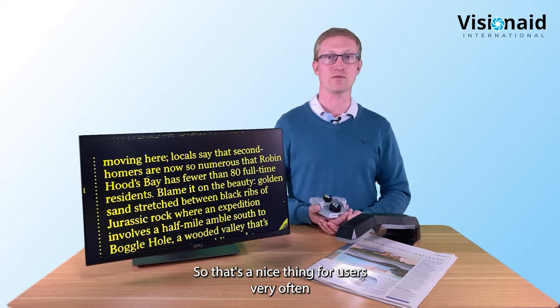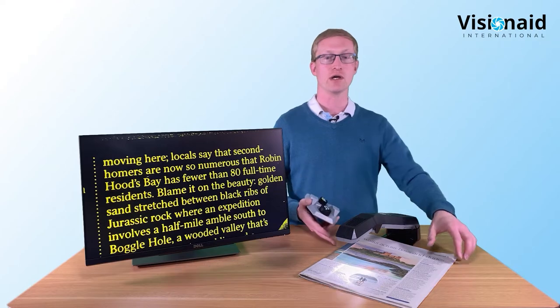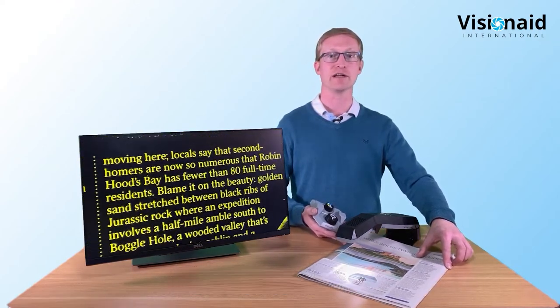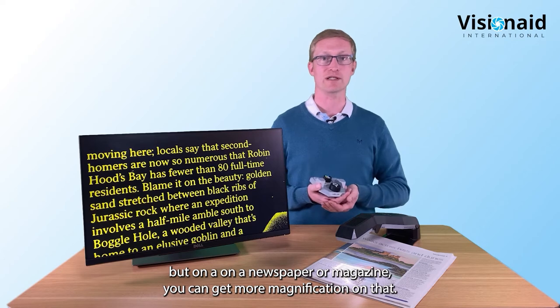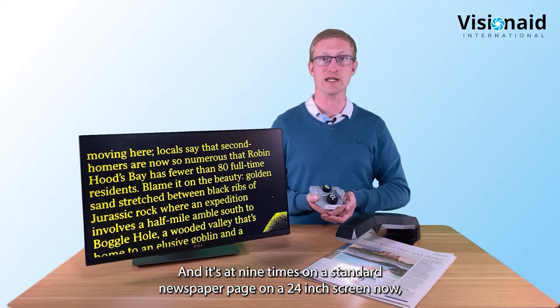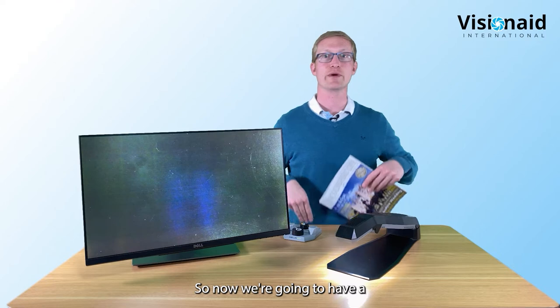Nine times on a standard newspaper page on a 24-inch screen is a really good magnification level for reading full column width without sliding the page. For a full-width A4 sheet you need higher magnification, but for newspapers and magazines this is very comfortable and usable.